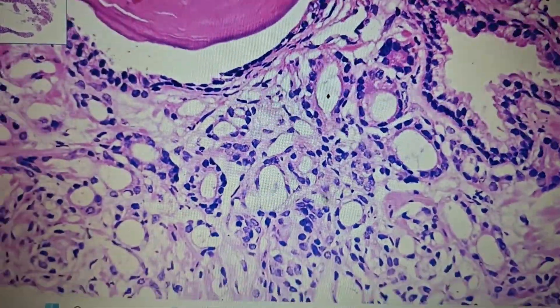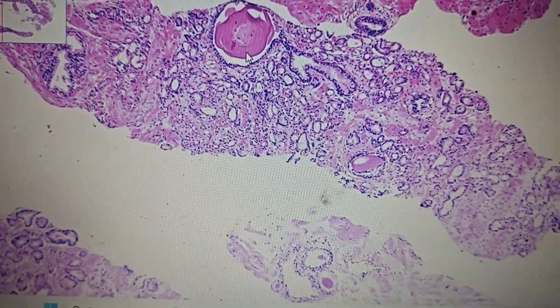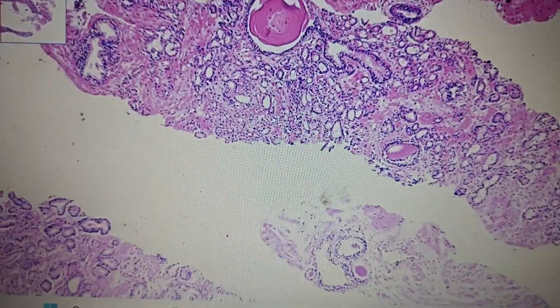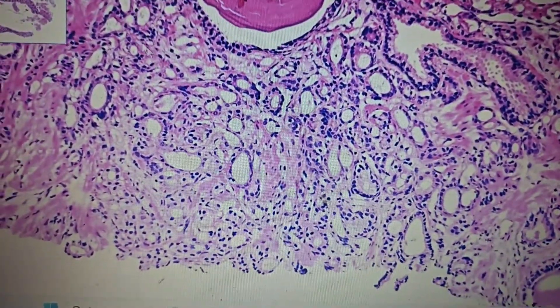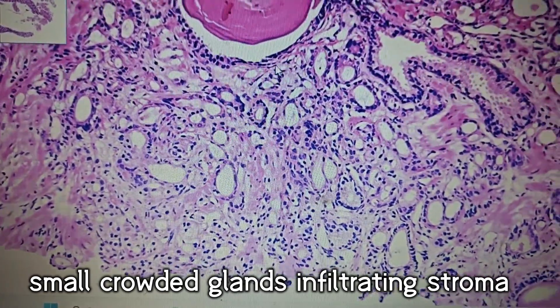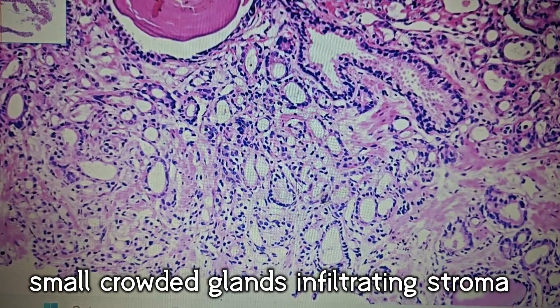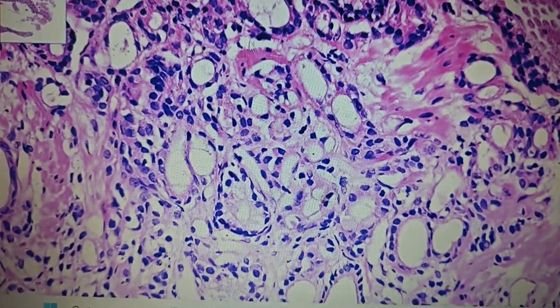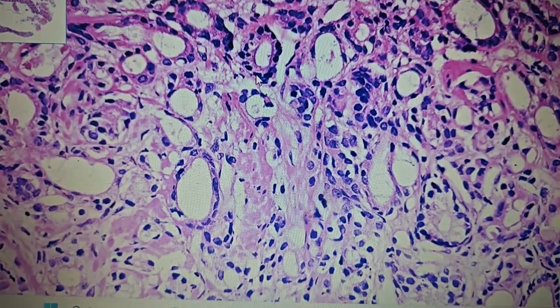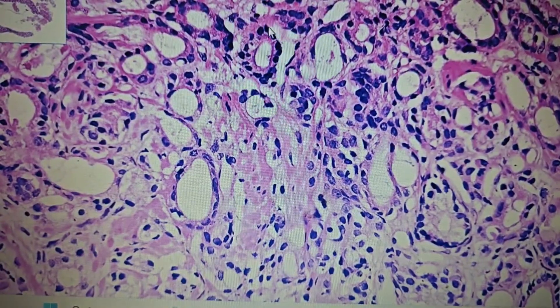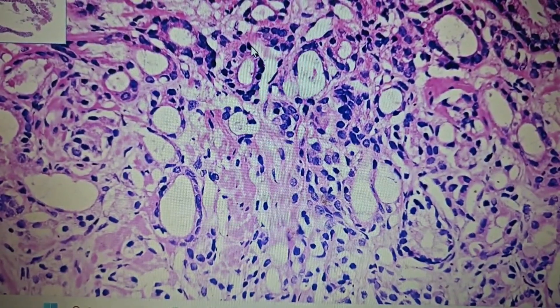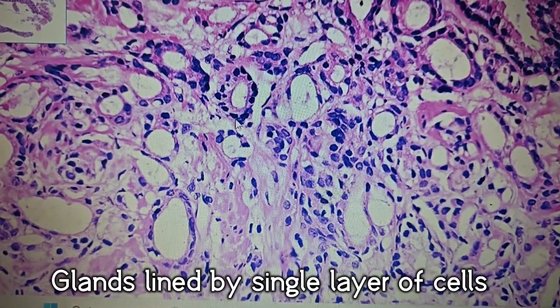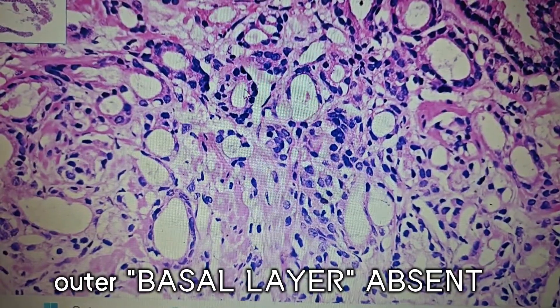Now let us look at the pathology. In between the benign glands, we can see some infiltrating glands — small glands which are a little bit crowded. These crowded glands are small in size and somewhere appear to be arranged back to back, though we can still appreciate some stroma between them. Let's zoom in to understand their cytology. These glands are smaller in size compared to the normal benign prostatic glands.